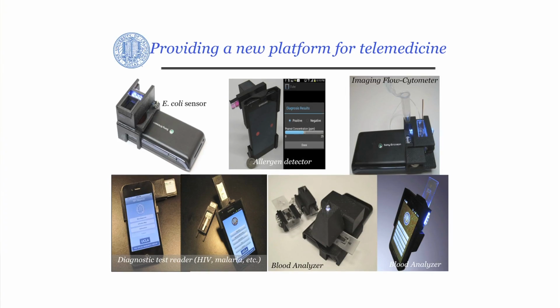This is a universal reader that can capture images and quantify rapid diagnostic tests, so that you can work with a bunch of diagnostic tests in field conditions and quantify the reports using a smartphone, and then distribute the results using a Google Maps interface so that you can build an epidemiologic tool set for tracking of diseases as a function of space and time.